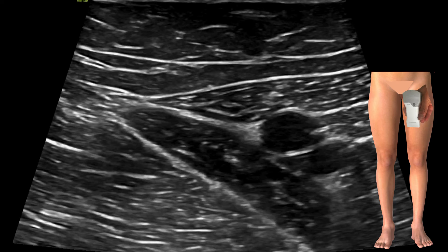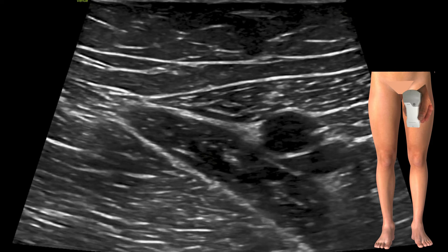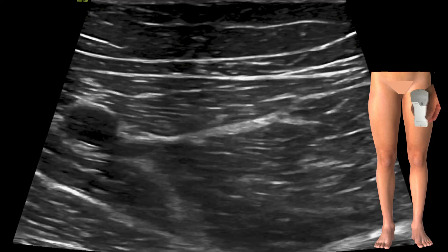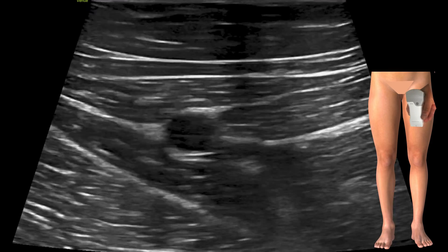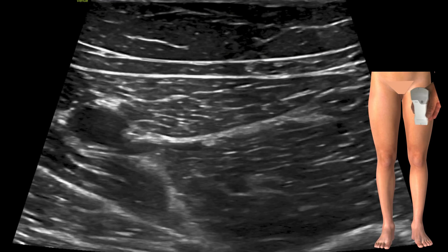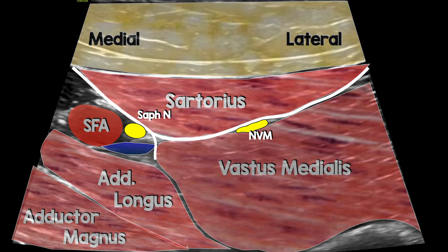Having found the apex of the femoral triangle, we slide laterally, scanning up and down to identify structures lying in that interspace between sartorius and vastus medialis. By increasing and releasing pressure to blot the superficial femoral vein, we look for the saphenous nerve lying right next to the femoral artery. Adding labels, you can see the nerve to vastus medialis lying between sartorius and vastus medialis, the saphenous nerve next to the superficial femoral artery, and the slightly thickened white line — the vastoadductor membrane — just deep to sartorius, separating the two compartments.